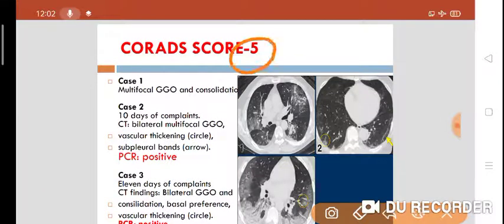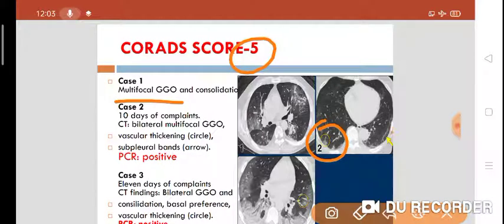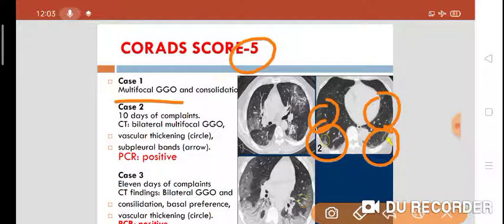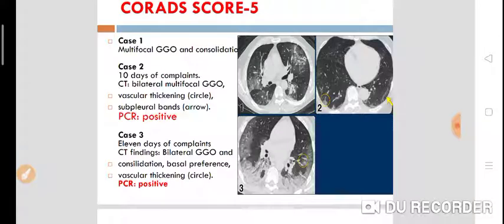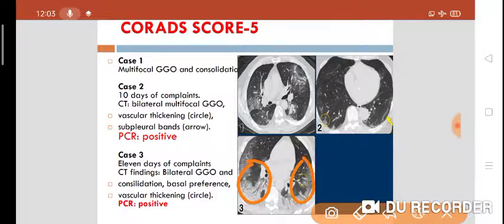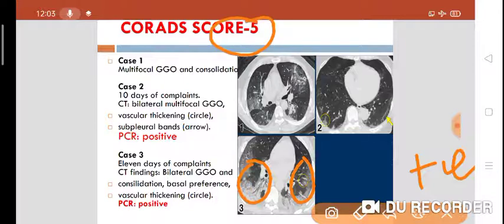CO-RADS score 5 means there are very high chances of COVID-19 illness. In case 2, a 10-day complaint with bilateral multifocal ground glass opacities, vascular thickening, and subpleural bands — PCR positive. In case 3, an 11-day complaint with bilateral ground glass opacities, multifocal consolidation with basal preference, and vascular thickening — RT-PCR positive. All findings are typical of COVID-19 illness.